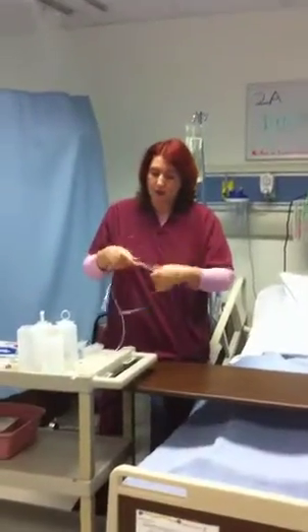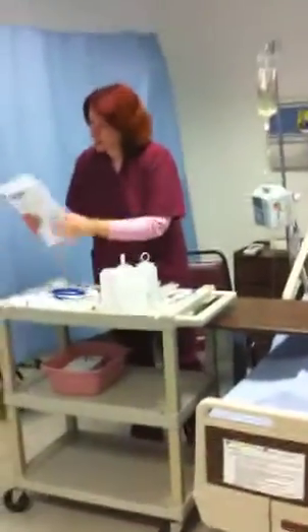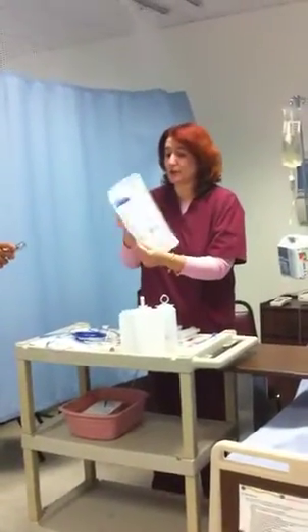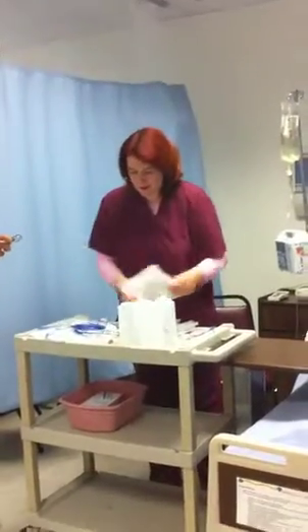So we have our tubing. They usually come in this packaging. So this is saline sump, and it's French 12, which is not very large. So this is what the packaging looks like.